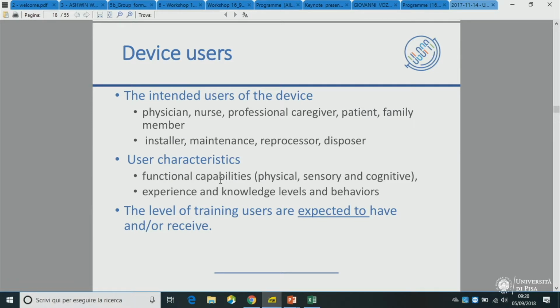That's what they're going to look for: a nice little icon for switching it on, and they will push that, even if they are perfectly aware that there is no battery, just to see what happens. Because this is what we do, right? When you buy a new telephone, you just want to switch it on. And then maybe you will charge it, and possibly read the instruction manual, but the very first thing is that you touch. This is just human, okay? That's the way we are, we have evolved.